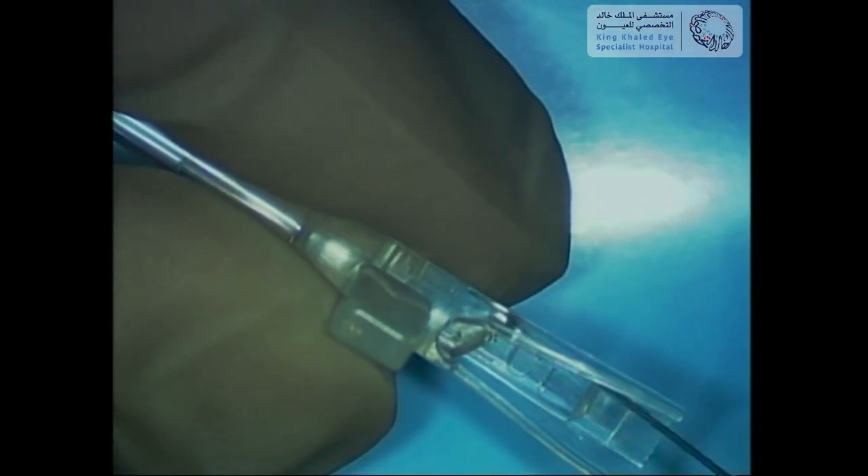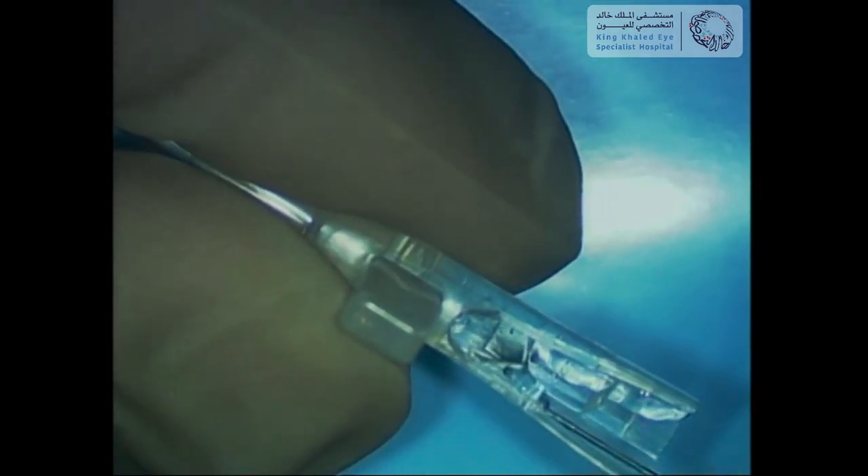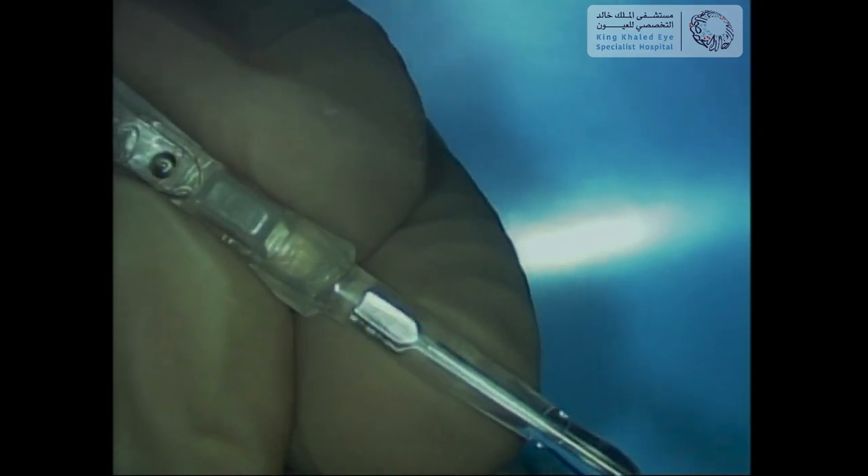First, the cartridge is filled with viscoelastic material in preparation for ICL loading. The ICL is then held gently from the side with a special forceps. The lens is then loaded into the cartridge, maintaining proper orientation and curvature. The ICL grasper is then advanced through the anterior opening of the cartridge to hold and pull the ICL gently up until the tip of the cartridge.